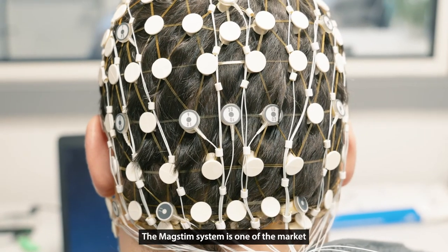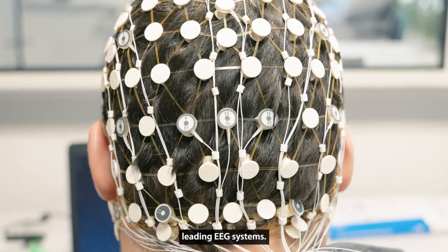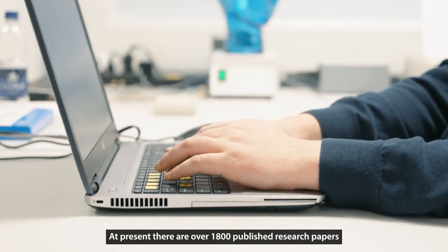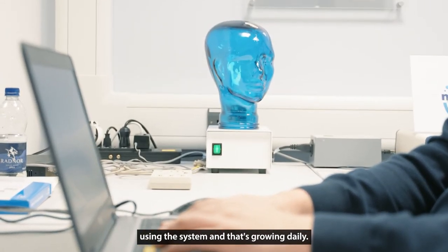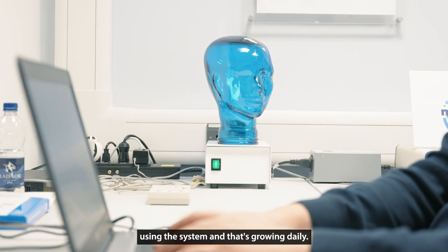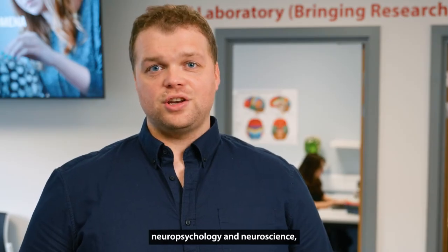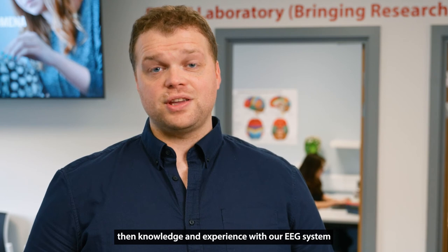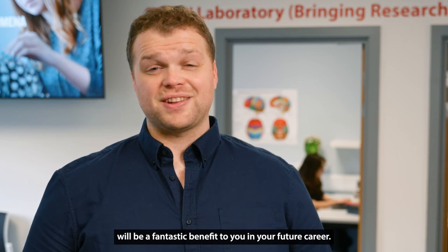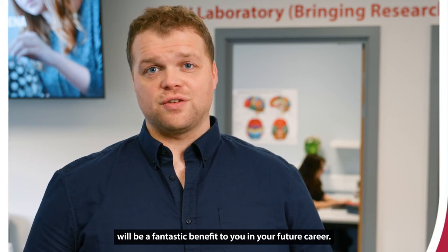The Magstim system is one of the market-leading EEG systems. At present, there are over 1,800 published research papers using this system, and that's growing daily. If you're interested in a career in neuropsychology or neuroscience, then knowledge and experience with our EEG system would be a fantastic benefit to you in your future career.